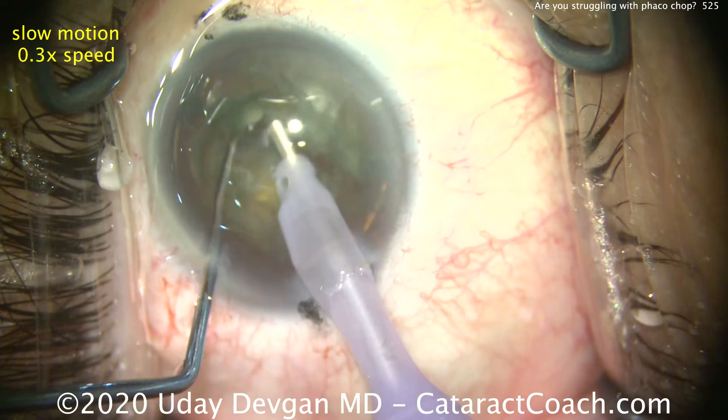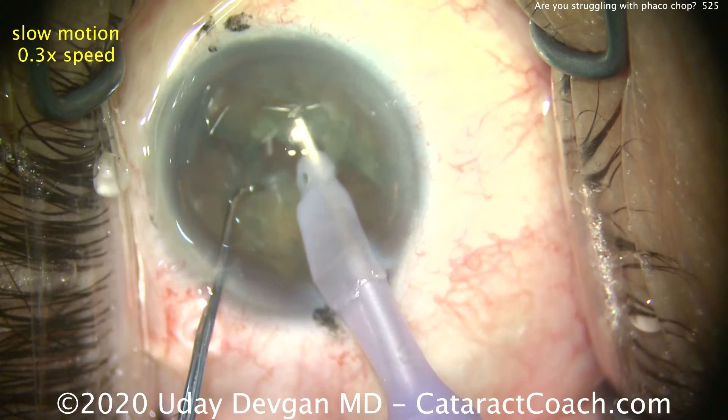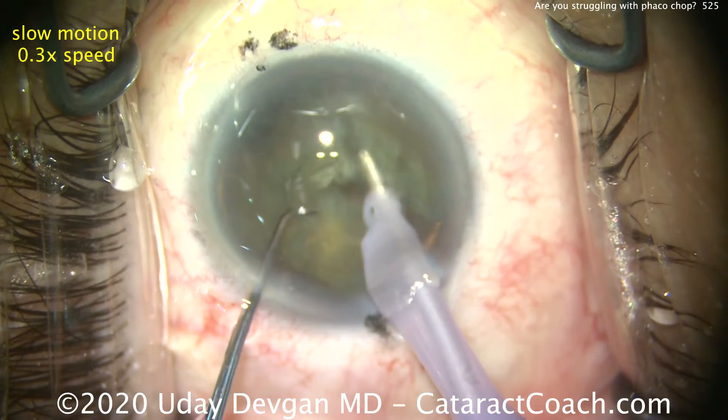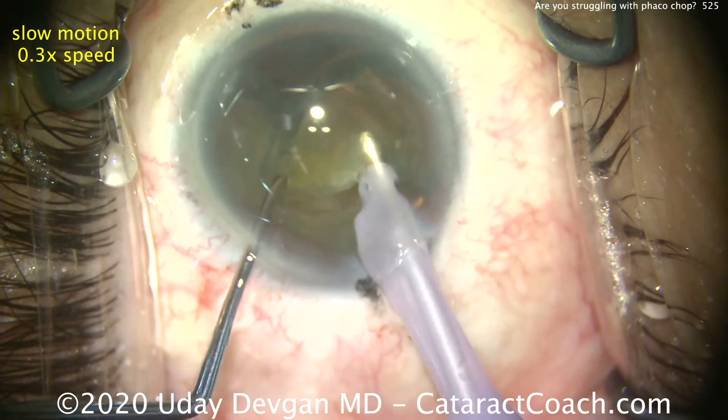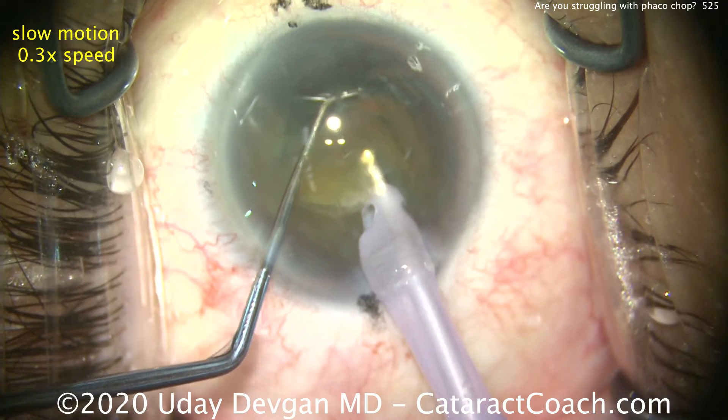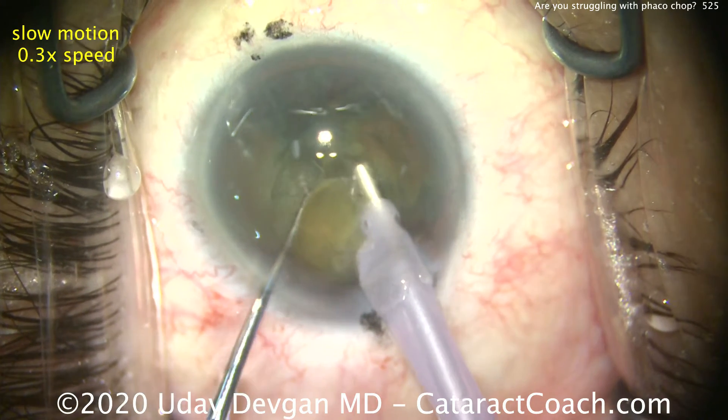We take our time to really propagate that crack. Now buzz into the first hemi nucleus, bring it up. Notice we buzz in the corner, not the middle. I want to bring up one corner of it. Now the chopper goes around and we simply bring it towards the FACO tip and pull the pieces apart.